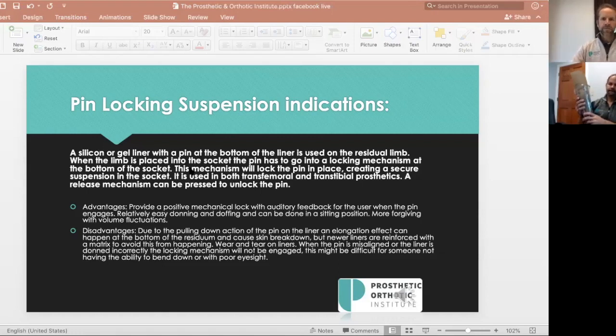So we talked about socks and the importance and changing those out and how that changes throughout the day. With a suction or elevated system or a vacuum system, do you have to have socks for those systems? You do. Well, when we get into elevated vacuum here, we'll cover that. Research shows the industry standards for elevated vacuum and suction, especially, is to get rid of prosthetic socks. Right. But with that, we've got to have a limb that is somewhat stable, or that we can potentially stabilize with the use of a total surface bearing socket or a vacuum elevated socket, suction socket. That will help eliminate those socks. It also helps eliminate one aspect that we're going to talk about, which is pistoning, right? Because we have the volatility and the fluctuation of edema as a result of the pistoning inside of the pin locking system.